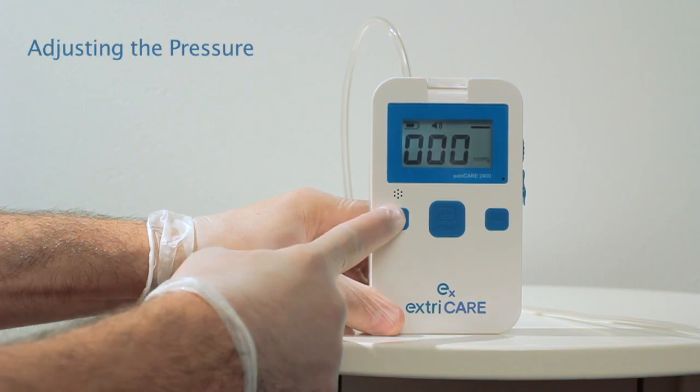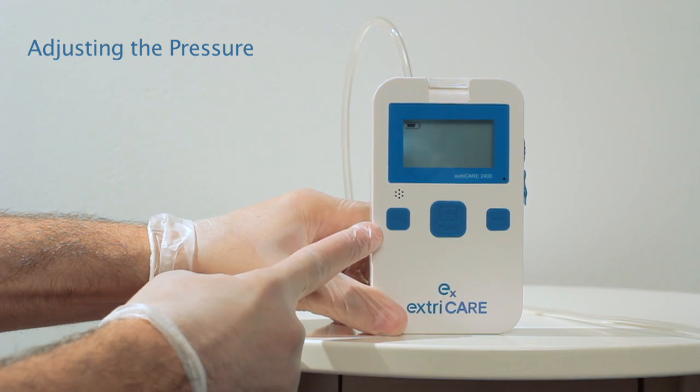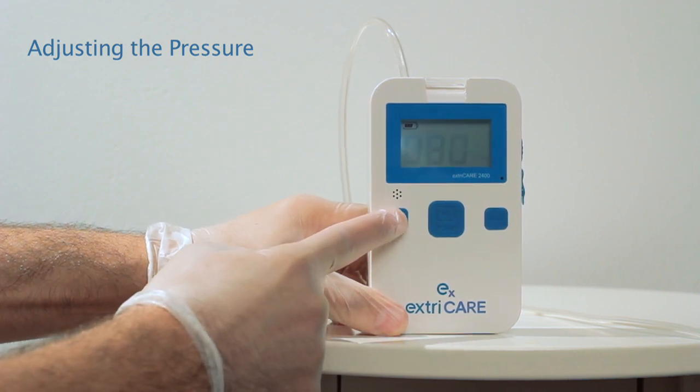To set the pressure, hold down the VAC button until you hear a beep. You will see a blinking number. To adjust the pressure, press the VAC button.